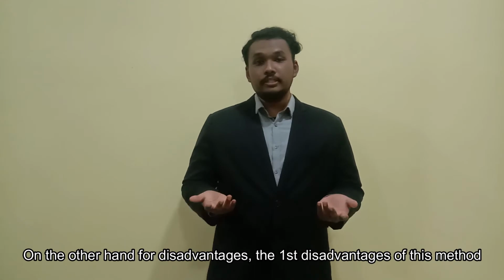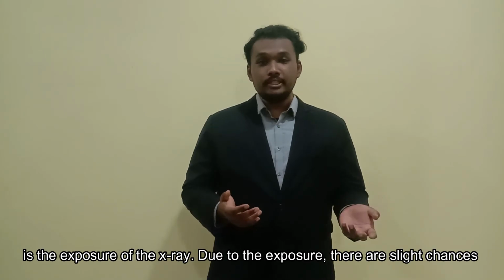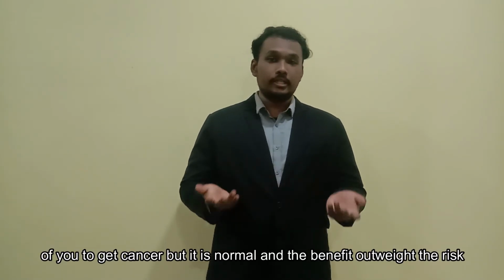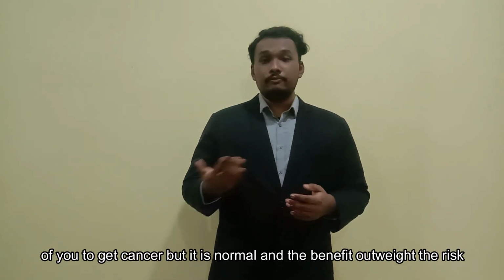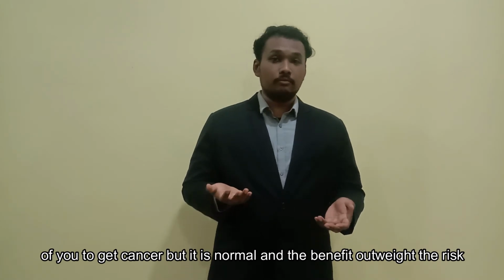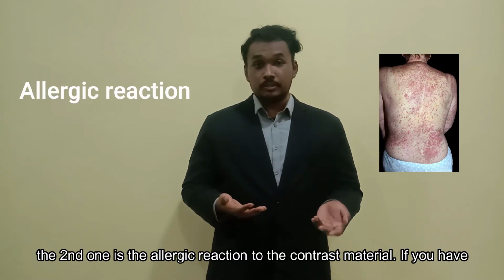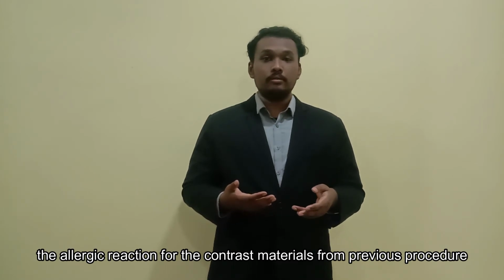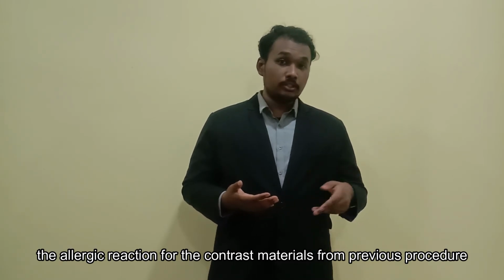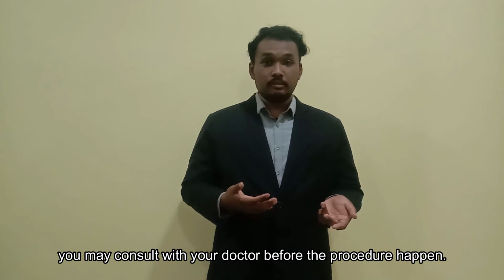On the other hand, for the disadvantages, the first disadvantage of this method is the exposure to X-ray. Due to the exposure to radiation, there is a slight chance of you getting cancer, but it is normal, and the benefit from the procedure actually outweighs the risk of getting cancer. The second one is an allergic reaction to the contrast material. If you have had allergic reactions to contrast material or dye from a previous procedure, you may consult a doctor before the procedure happens.